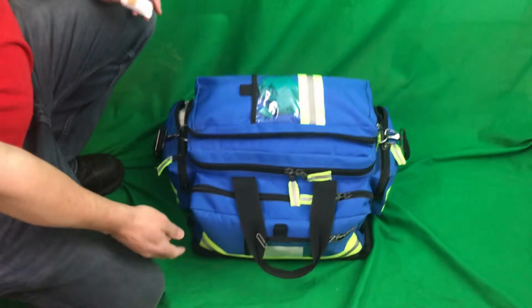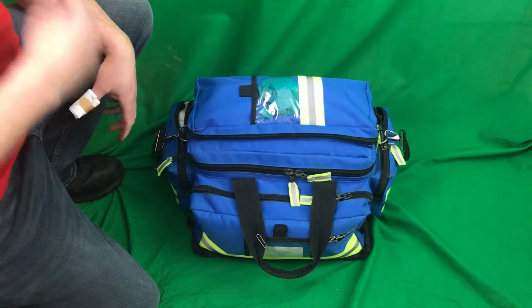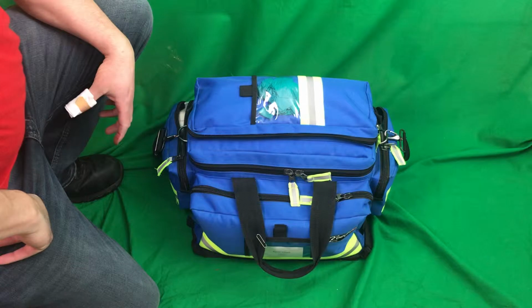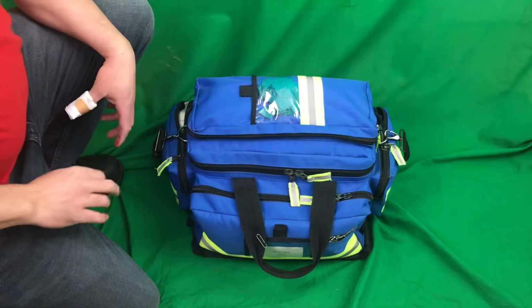The way this bag is designed, I do have some medicines in the front, but I don't have it stuffed with bandages like most people do. The thing about bandages is you don't need as much as what most people say. A couple of abdominal pads usually stops any kind of bleeding in my 20 years experience. And the ones that are really bad, like legs almost cut off or anything like that, you put a tourniquet and it stops. So I have it set up more like tools for other kinds of things.